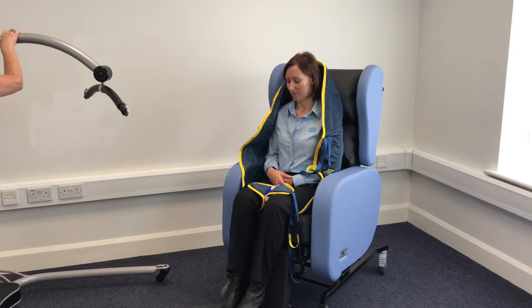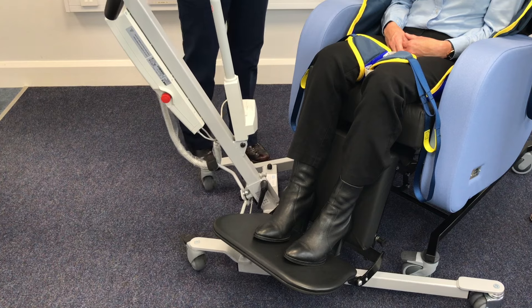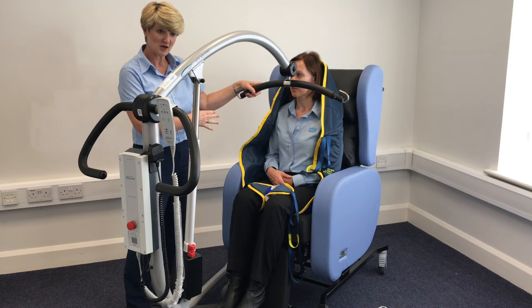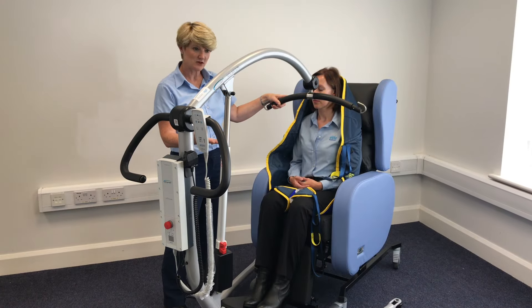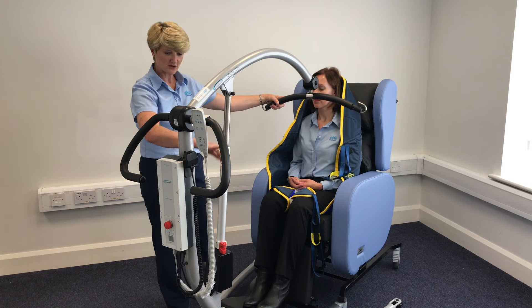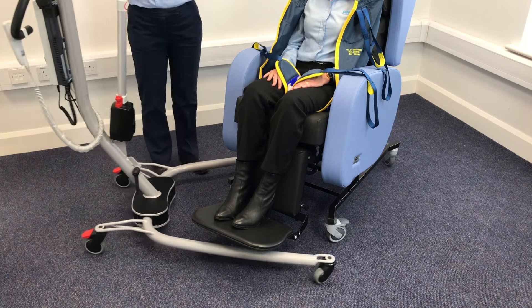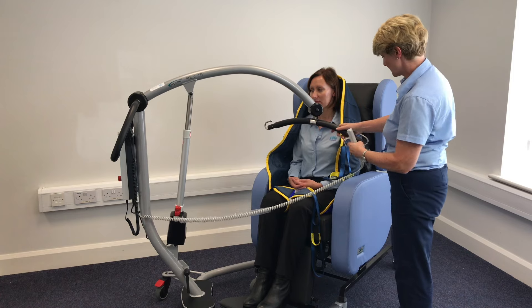When you have the sling on — that's the hardest bit of the work really — in you come with your hoist. I like to come in at an angle. Everybody seems pre-programmed to come in from the front. For picking up it's not too bad, but for landing you definitely need to come in from a side angle. Clients can be quite frightened, particularly maybe an elderly lady with leg ulcers on her shins — she's going to be terrified of the mast of the hoist in front of her. So why not just throw that off to the side? It also gives you much better clearance. So here I have my handset. I'm just going to bring the spreader bar down. This is a two-point spreader bar.